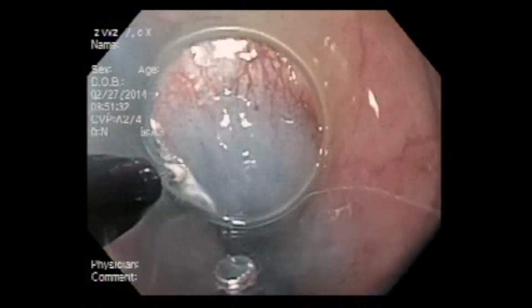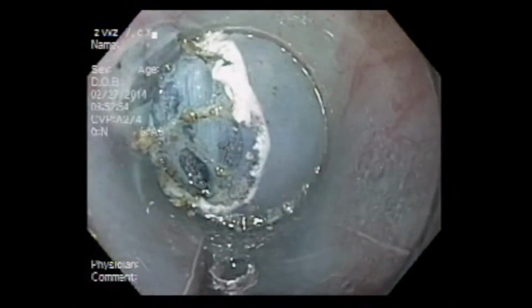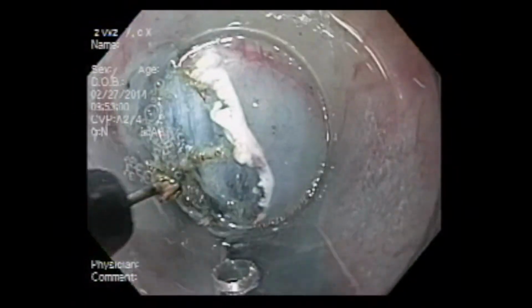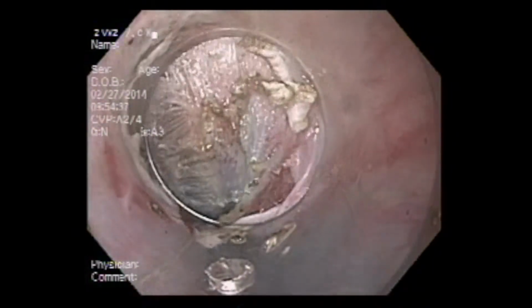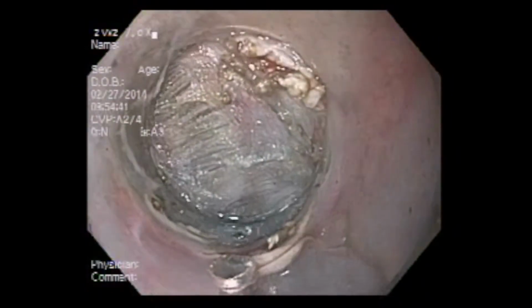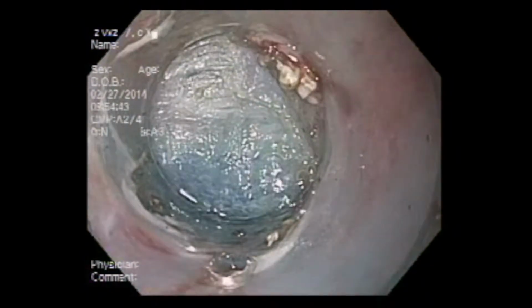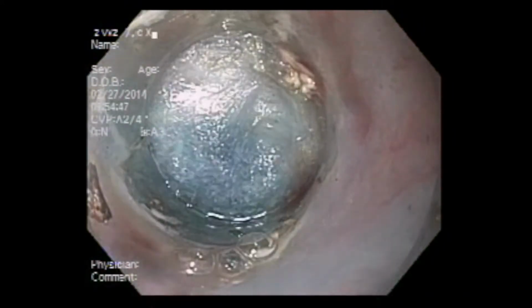This should facilitate introduction of the endoscopic mucosal resection cap and the endoscope. Entrance is facilitated by a combination of electrocautery and blunt dissection. Once an adequate mucosotomy has been performed, the endoscope and resection cap are tipped into the dissection plane. This should aerate the areolar tissues, and further dissection is required utilizing electrocautery.